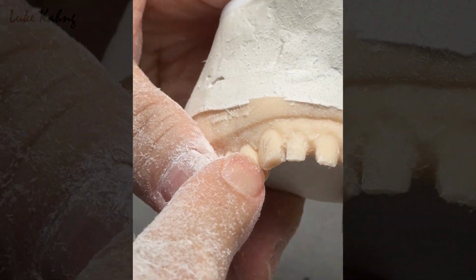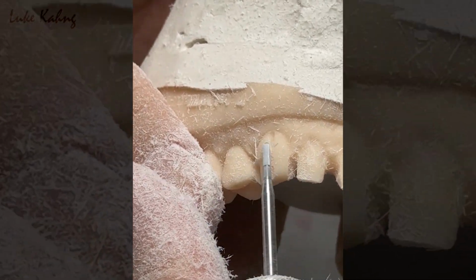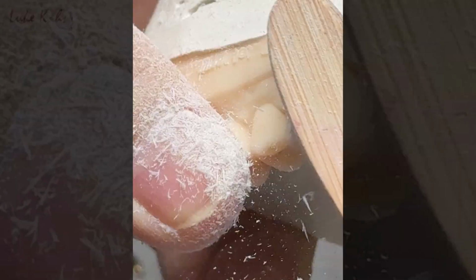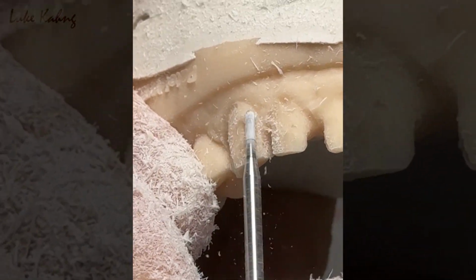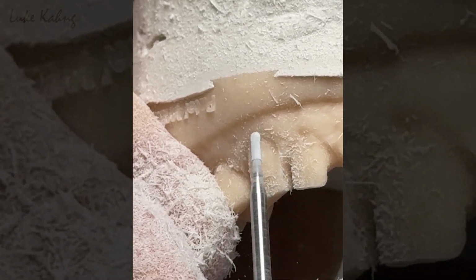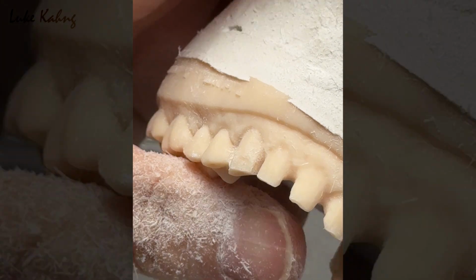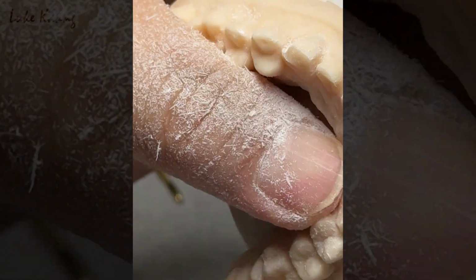Now this one needs more prep here. Like this. Here too tall, straight.